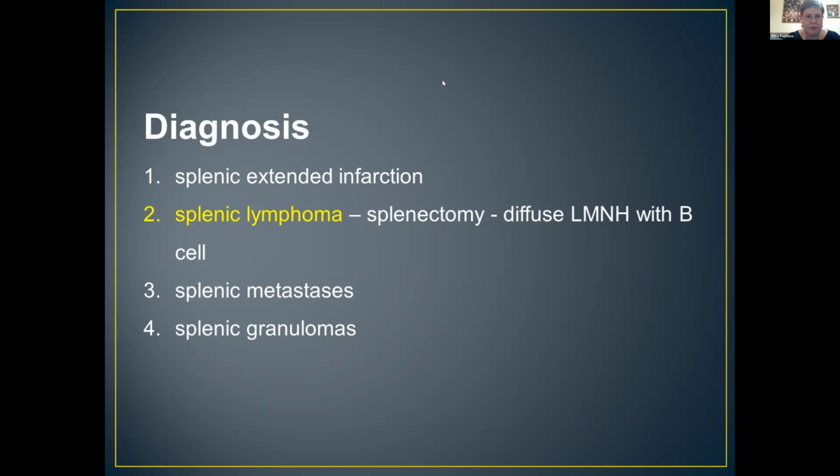This was also my first suspicion, even that I haven't seen all the case. Of course, when you see the patient, and if you have any other suspicion that can be somewhere another primary tumor, you can think also of metastasis.